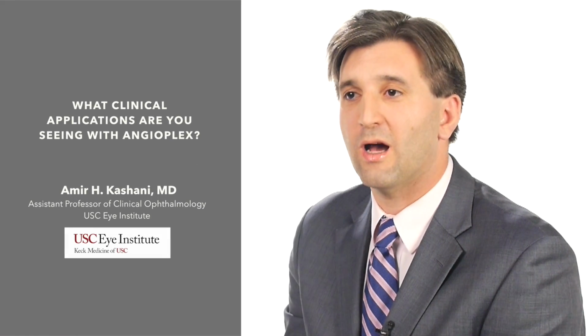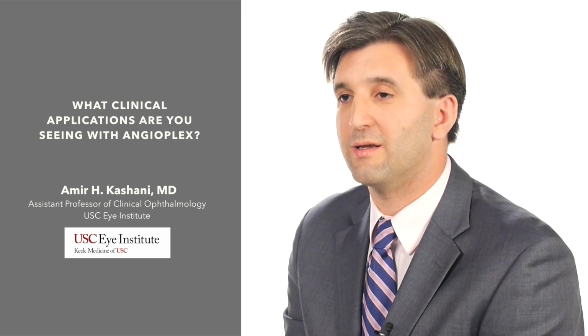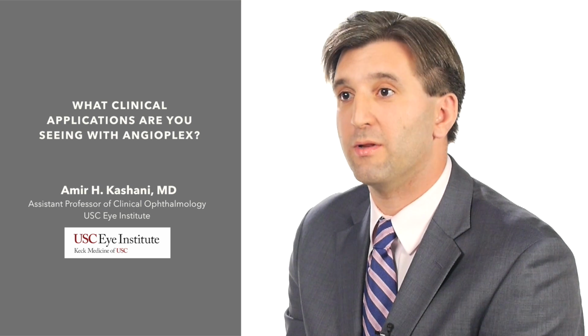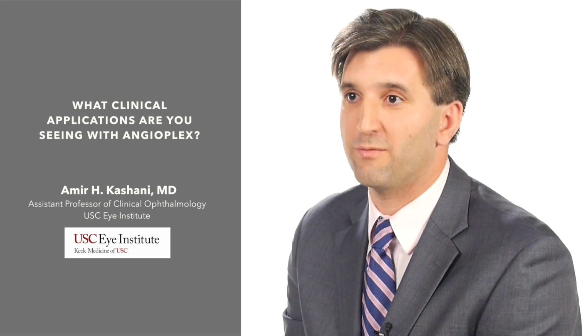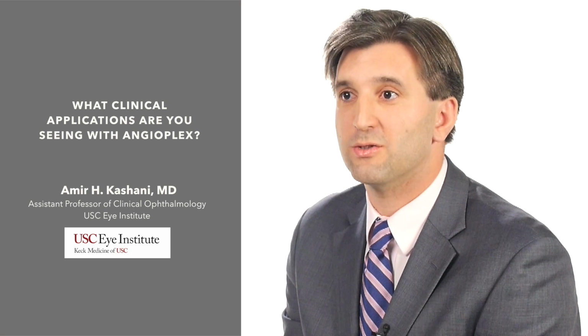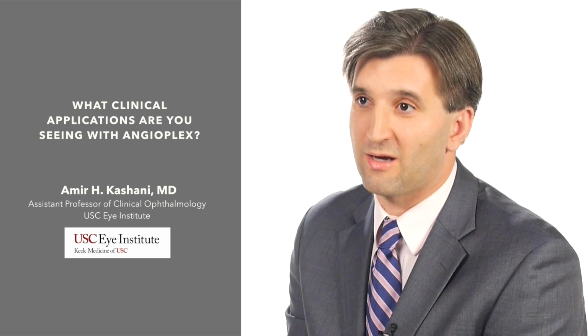So I think that there's a lot of potential applications, and one really obvious one is, for example, diabetic retinopathy. Diabetic retinopathy is characterized by changes in the vasculature that cause what we call capillary dropout or impaired capillary perfusion. And that's exactly what OCT angiography or Angioplex is going to allow us to look at now, because we can see exactly where there is blood flow and where there is not blood flow.